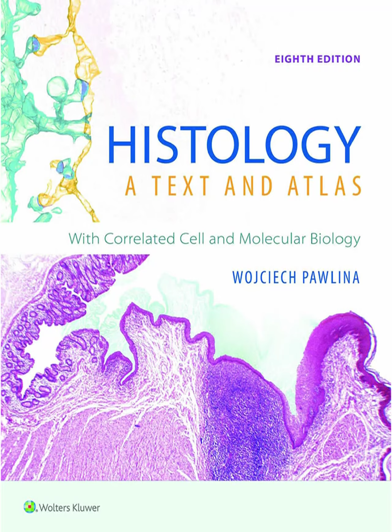Okay, this is getting really specific. Now, what about pinpointing individual proteins or even specific gene sequences within a cell? That sounds like the next level. Absolutely. That brings us to immunocytochemistry, or ICC. This technique is built on the incredible specificity of the immune system. Antibodies. Exactly. The highly precise lock and key fit between an antigen, the target molecule you're interested in, and an antibody designed to recognize it. We take these antibodies and tag them, maybe with a fluorescent dye for light microscopy, or an electron-dense marker like gold particles for electron microscopy.